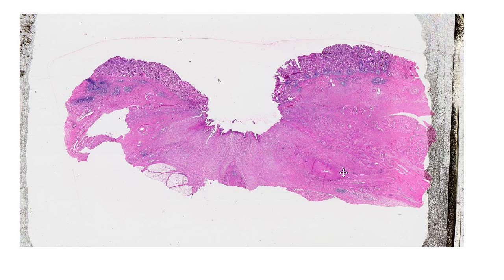And beneath that, we have subserosal connective tissue, which is a little bit of adipose tissue, some blood vessels. And bounding that, we have a single mesothelial cell layer called the serosa. So we have 4 layers of the GI tract. Both on this side, they're preserved, as well as on this side. And in the center of this slide, we notice that the 4 layers of the GI tract are disrupted. This is a crater-like lesion. It is an ulceration where we have lost the epithelium and developed this crater.